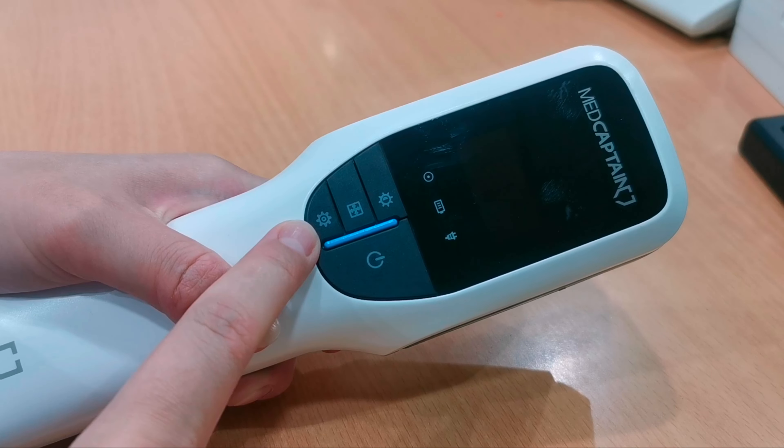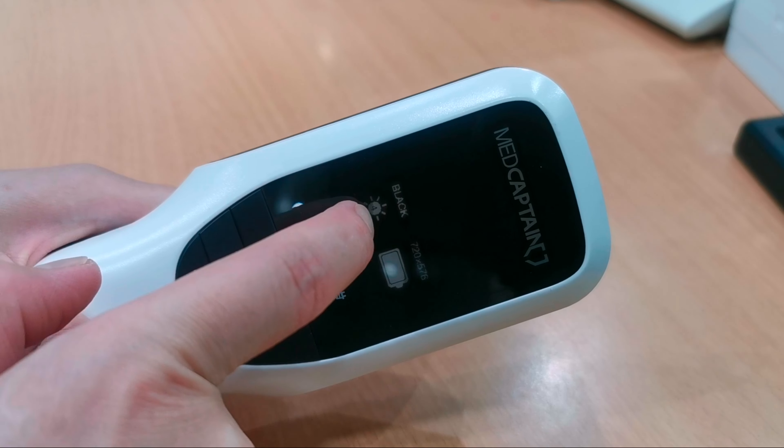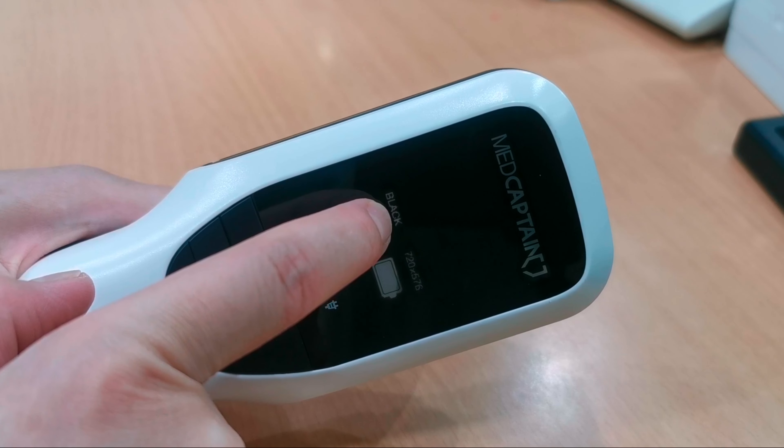Let's turn the device on by pressing the power button. As you can see, it displays 'black,' the charging status, and the number 4. This number is the brightness indicator. The color or mode indicator is also shown, as well as the battery status.